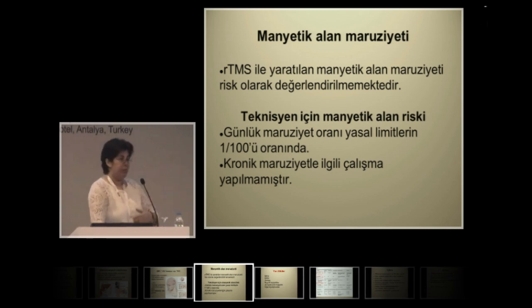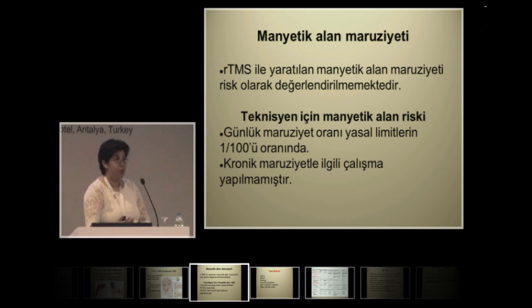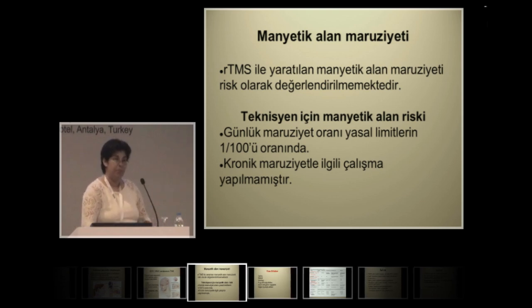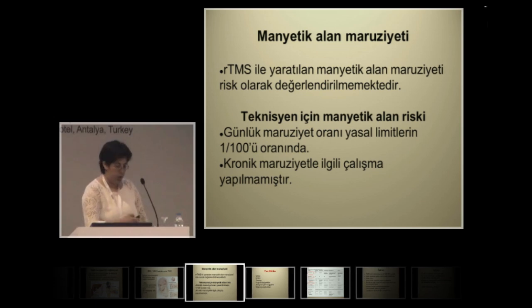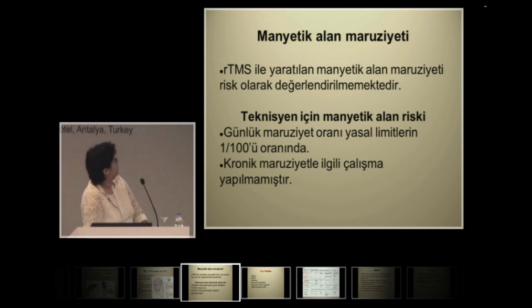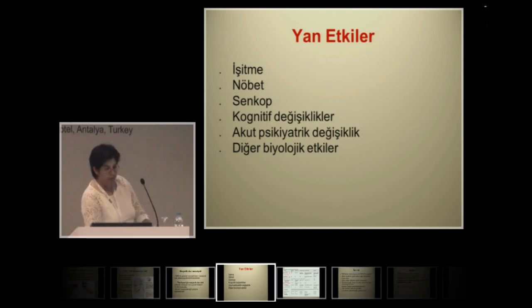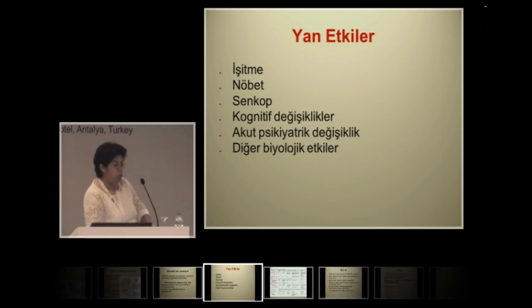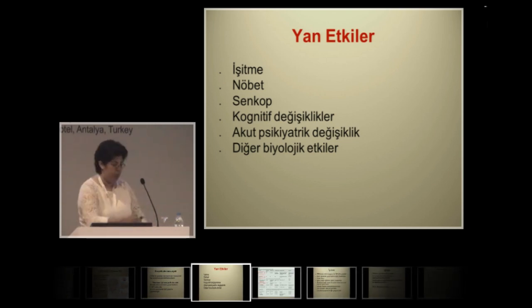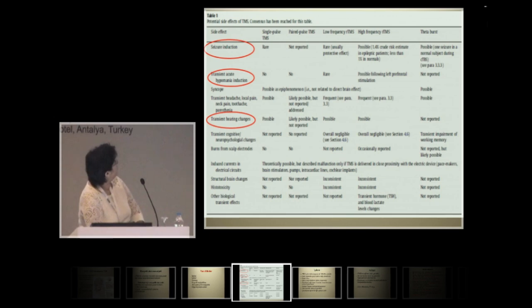However, the technician may have performed 10 such procedures in a day. It's a low risk, but we really don't know what will happen after a month or 3 months or a year when this procedure is continuously performed. We don't, unfortunately, have any safety data on this use, on the chronic use. Now let me discuss the adverse effects, which are hearing, seizure, syncope, and cognitive effects too.